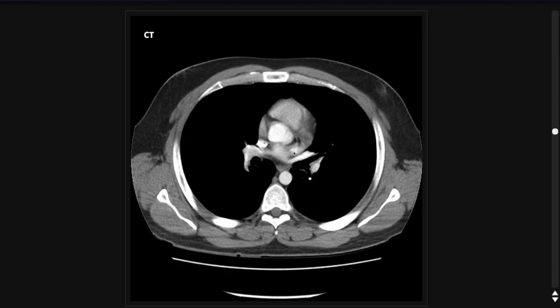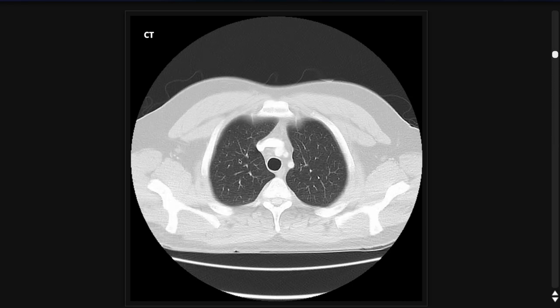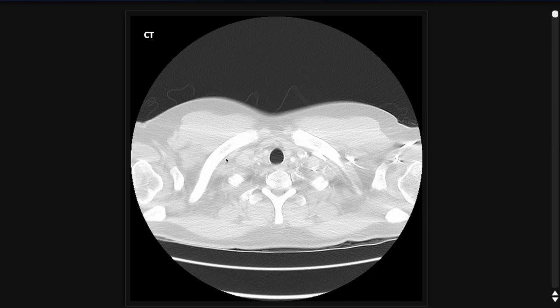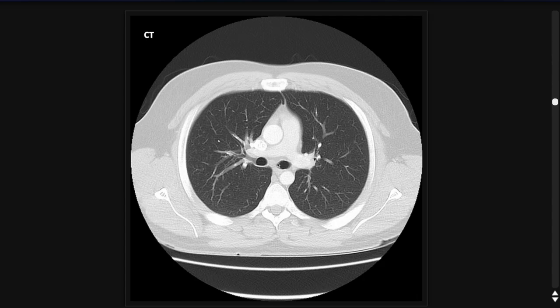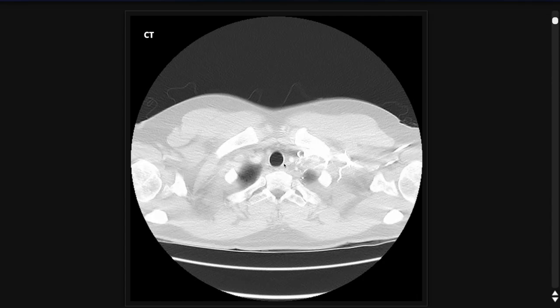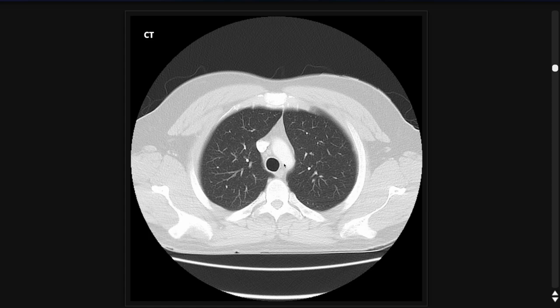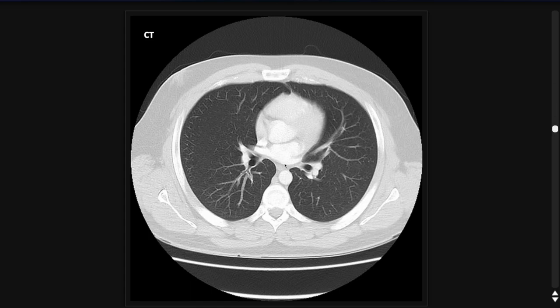After looking at lymph nodes, I then change to the lung window and go straight to the lungs. The first thing I do is scroll all the way to the top, focus in on the trachea, and follow it down until it branches into the main stem bronchi. This is a good example of a normal trachea.